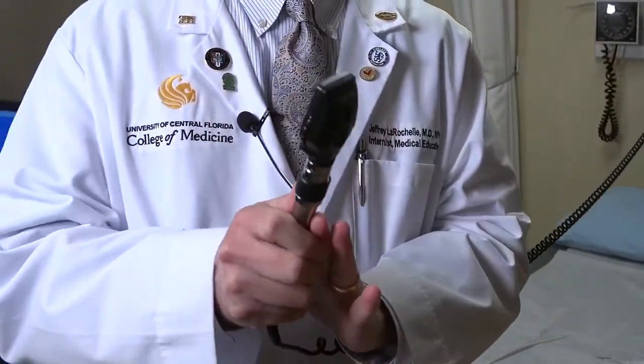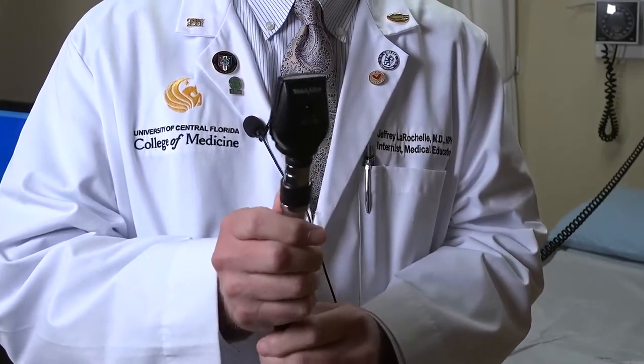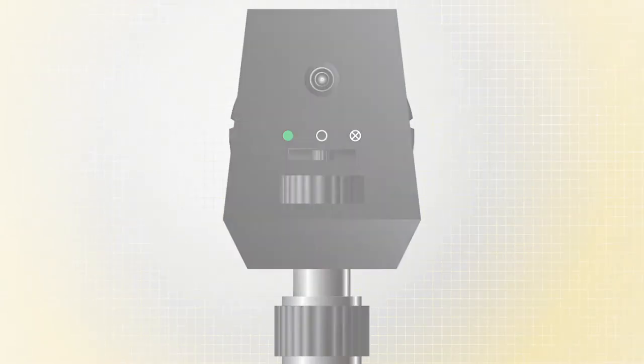So this is the basic handheld ophthalmoscope. In the front, you're going to see that there are sort of three filters and a little thing that you can push to one side or the other. You want to be on the middle filter. There's a green filter where you can kind of see blood in the retina. There's the middle filter which is sort of unfiltered. There's an X which is a polarized lens. You're going to want to be on the middle filter — that's basically your home base.